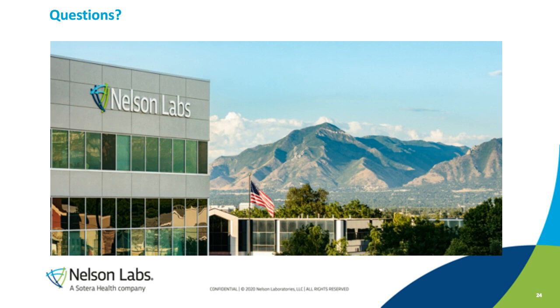Yeah, I do. It's compounding what you just said, which is most of the time if you do biocompatibility on a new device without being processed, if that's how a device could be used, so if the device is going to be used clinically without being processed the very first time, there could be residual manufacturing on there that your cleaning could remove. And so we'd want to perform the biocompatibility. But like Matt said, in a cleaning validation, we do want to make sure biocompatibility isn't impacted by either material breaking down during the cleaning and making new leachables or residual from the cleaning process itself.